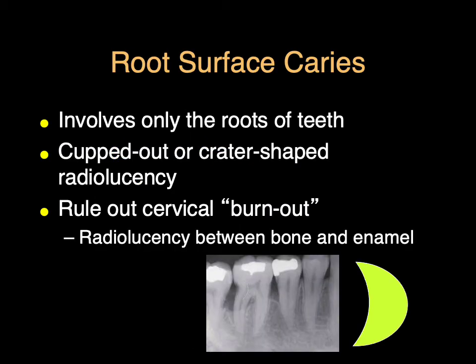Root surface decay is a significant problem especially in our geriatric population with xerostomia, because cervical decay is where we see xerostomia-related decay. It tends to be a cupped-out or crater-shaped radiolucency. We certainly need to rule out burnout when evaluating this, but here we can see a cupped-shaped radiolucency — different than burnout, which we'll discuss next.